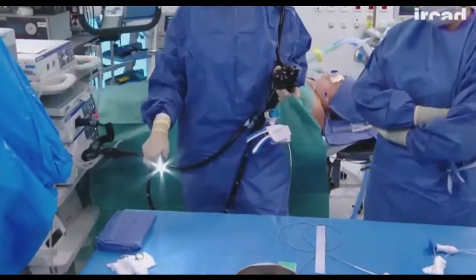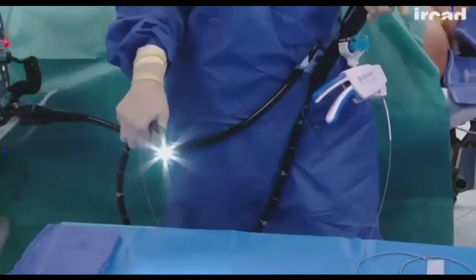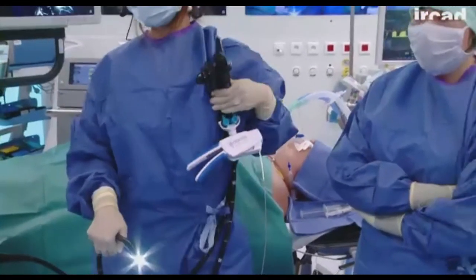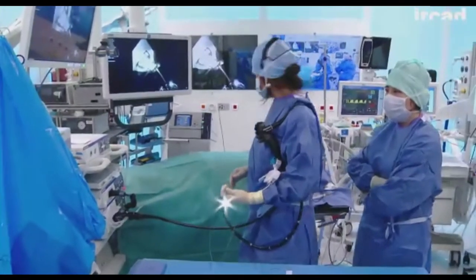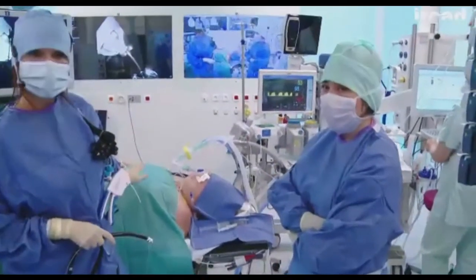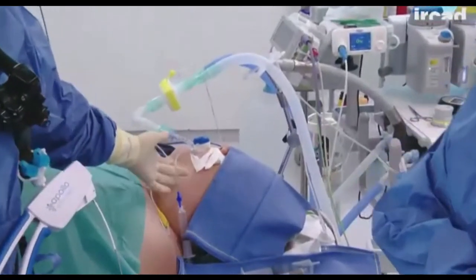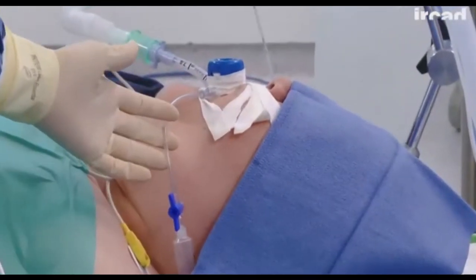Just before starting the procedure, I will very quickly talk about something very important, which is the position of the patient and the setting of the equipment. As you can see here, we're working in close collaboration with the anesthesiologists. The patient is lying supine under general anesthesia, and she is intubated, and I also position an overtube after having checked again that everything is fine with her esophagus and stomach.